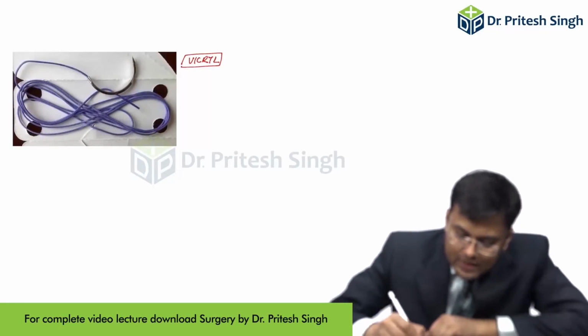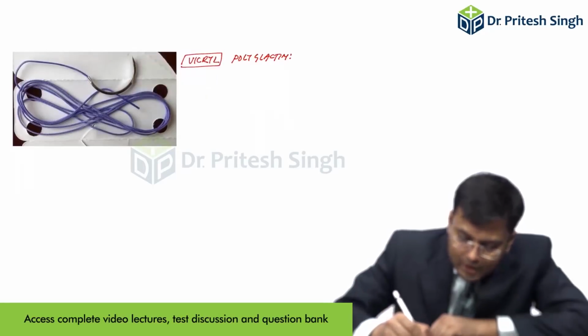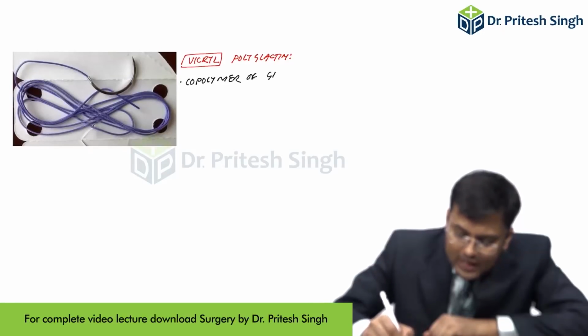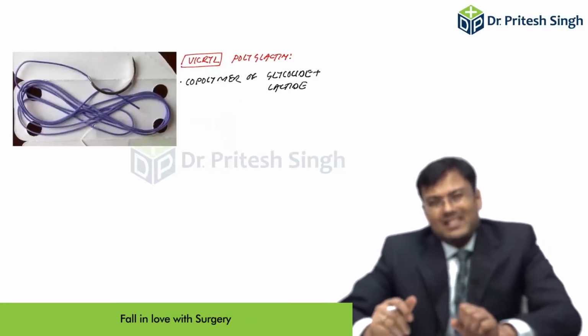It's also known as polyglactin. It's the copolymer of glycolide plus lactide.